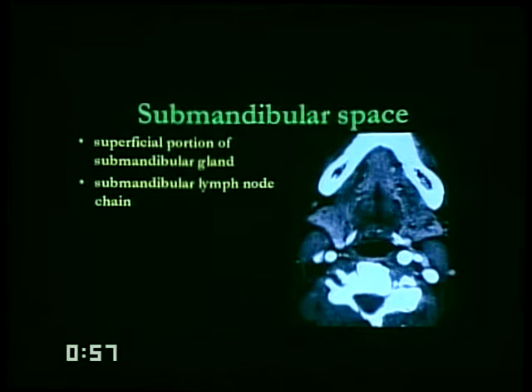It could be oriented in different planes. Again, very, very challenging to pick up very early sialadenosis or inflammatory conditions of the submandibular gland. Very heterogeneous texture using either CT or MR, and that is just a component. It's a reflection of the constitution of the salivary gland itself. Very difficult to diagnose tumors in that location.